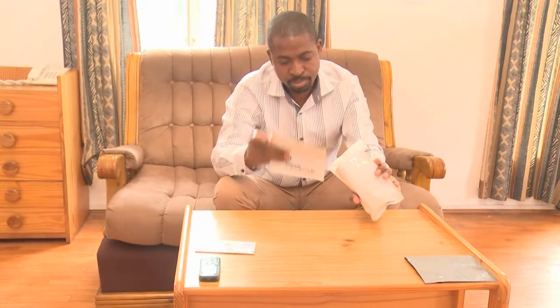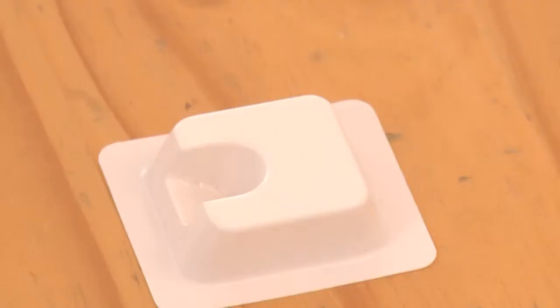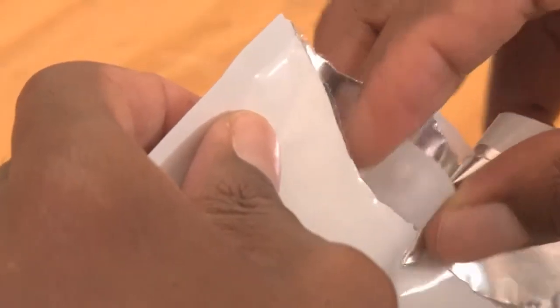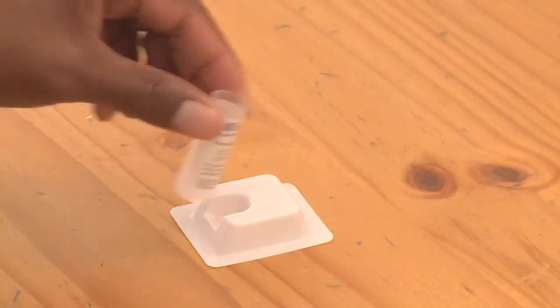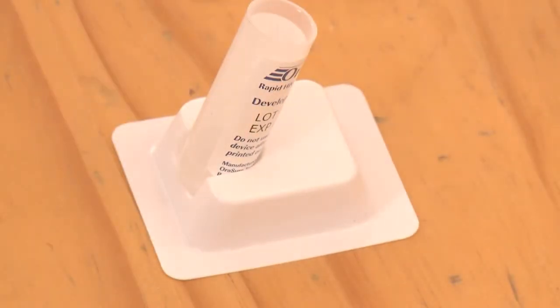Take out the instructions, test kit packet, and stand from the box. Your test kit packet has two pouches. First, open the pouch containing the small plastic bottle. The bottle contains liquid. Open the bottle by flipping open the cap. Carefully slide the opened bottle into the hole in the stand, taking care not to spill the liquid in the bottle.